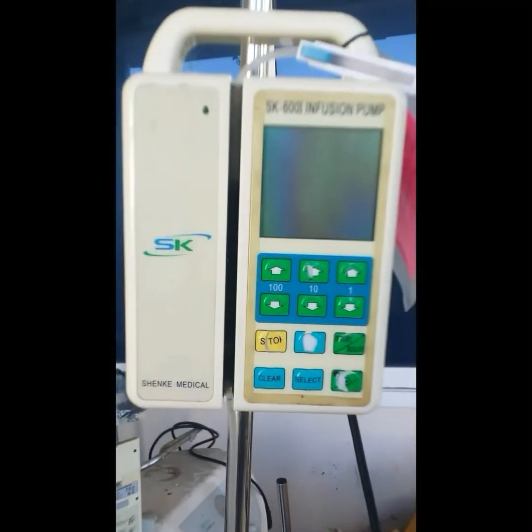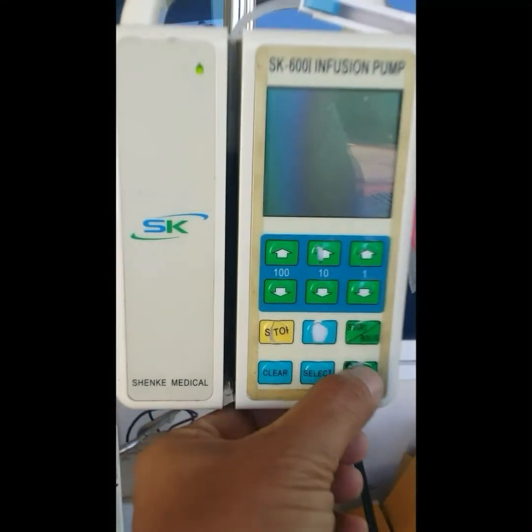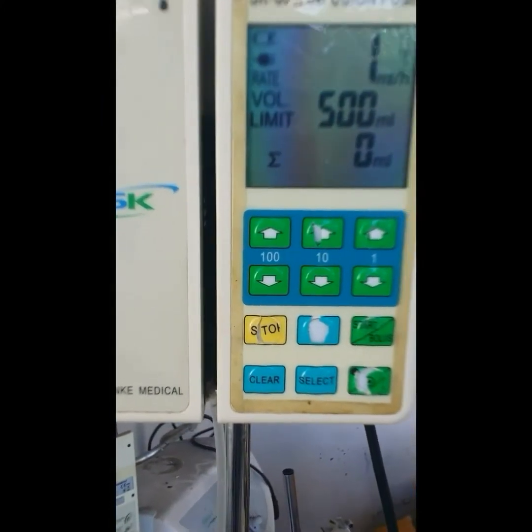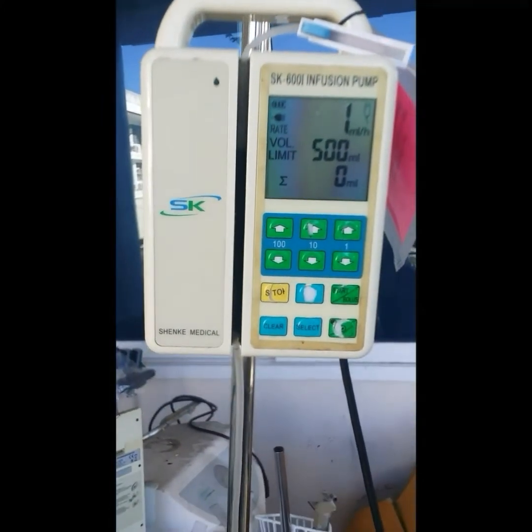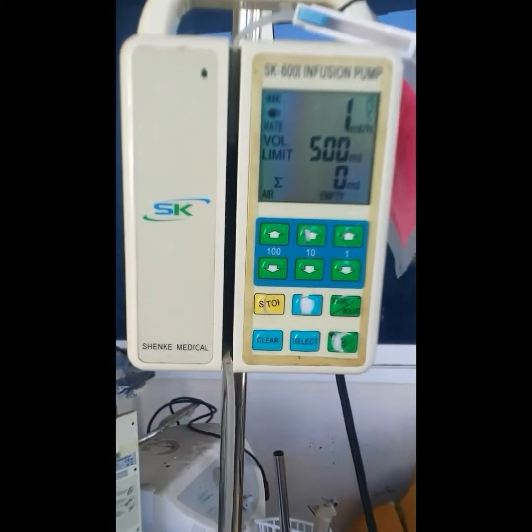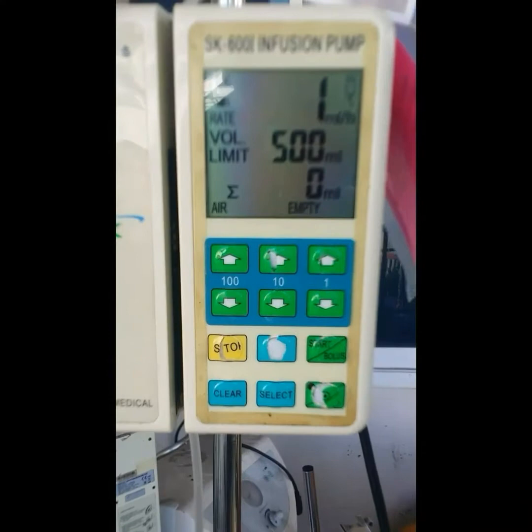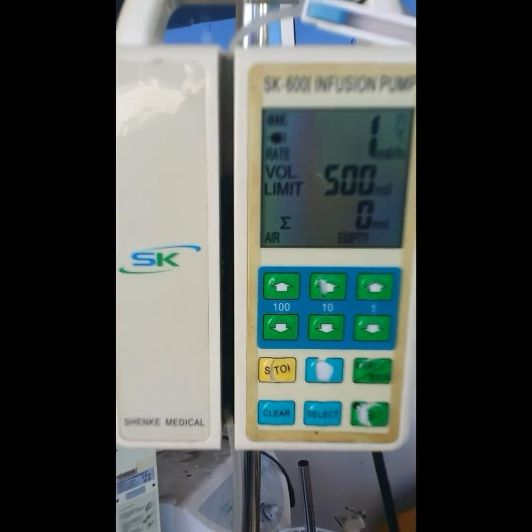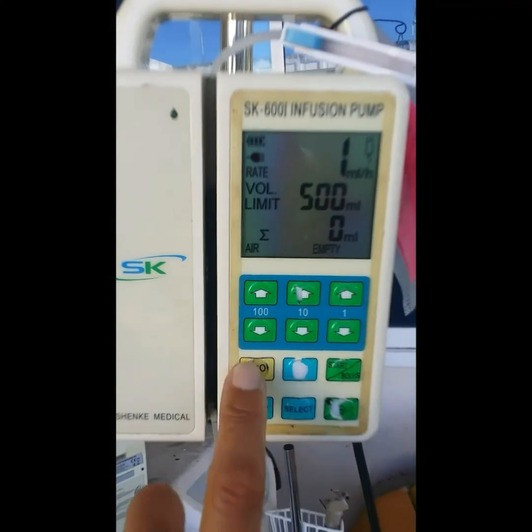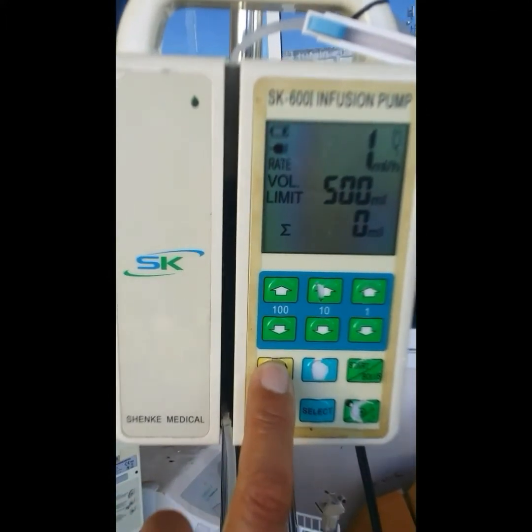Good day. I have here an infusion pump, the SK 600 — this is the old version. The problem with this one is it detects an air error, meaning there are no tubings or the tubings have air inside. So we're going to check this up and open up the infusion pump.